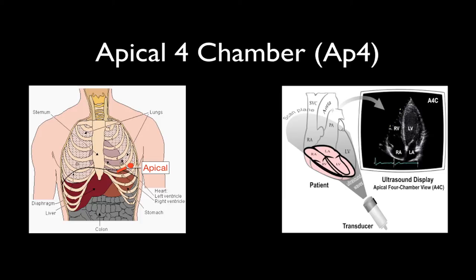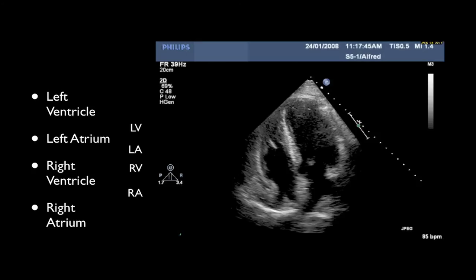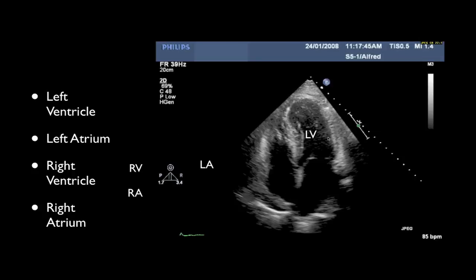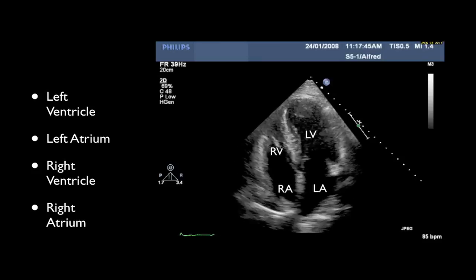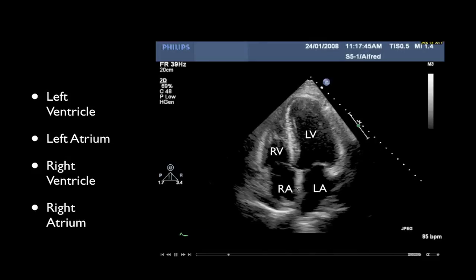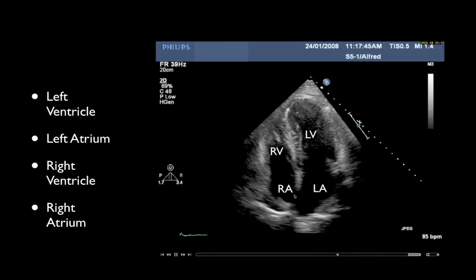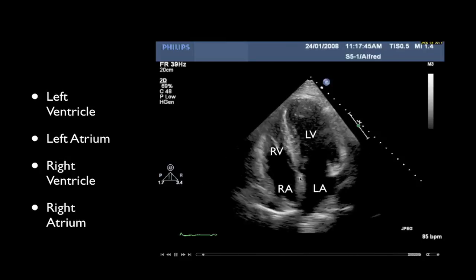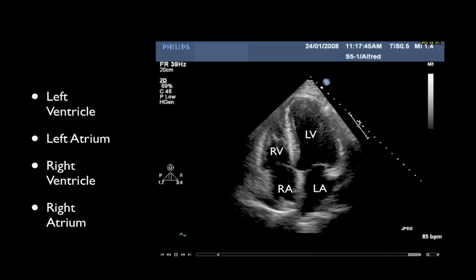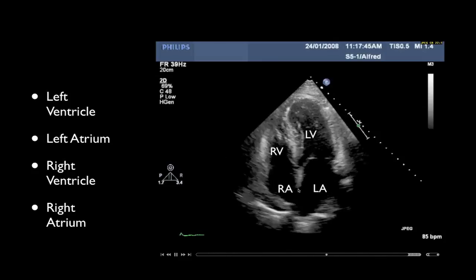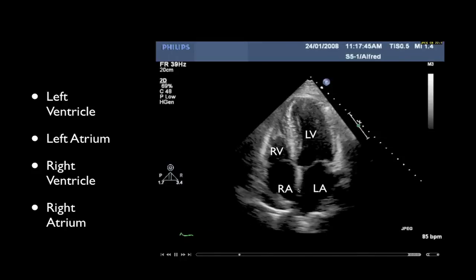Moving to the apical four-chamber view: the probe is in the fifth to sixth intercostal space, mid-clavicular to anterior axillary line, directed towards the right shoulder with the probe marker into the left axilla. The resulting image displays the left ventricle towards the probe marker side, the left atrium, the right ventricle with a moderator band which defines it as right ventricle, and the right atrium. It may look as though there is a hole in the interatrial septum — this is a normal appearance in this view, as the ultrasound beam runs parallel to the septum here, causing a dropout that can appear as a defect. To define an atrial septal defect, you need to image at right angles to it.